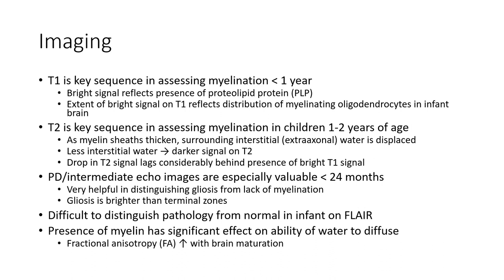PD intermediate echo imaging is useful in children less than 24 months. It is helpful in distinguishing gliosis from lack of myelination. Gliosis is brighter than unmyelinated white matter, making it difficult to distinguish pathology from normal myelination events. Myelination has significant effects on the ability of water to diffuse.